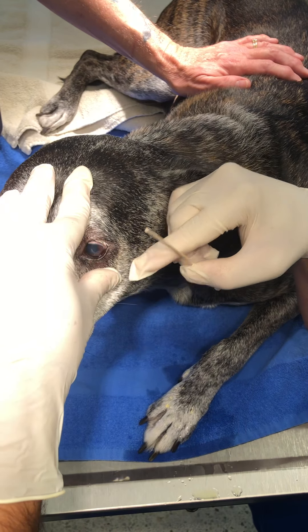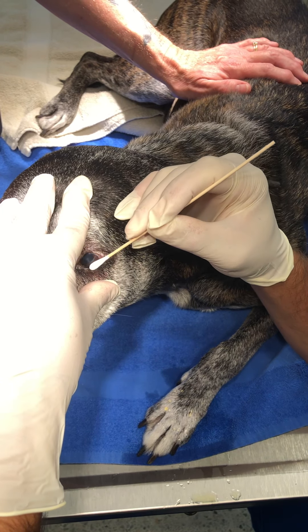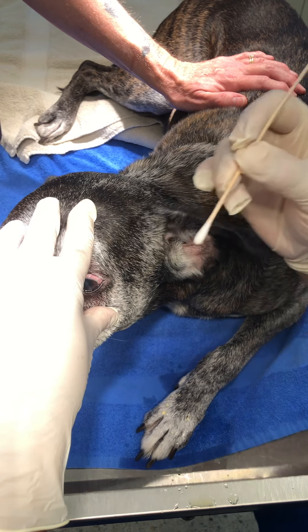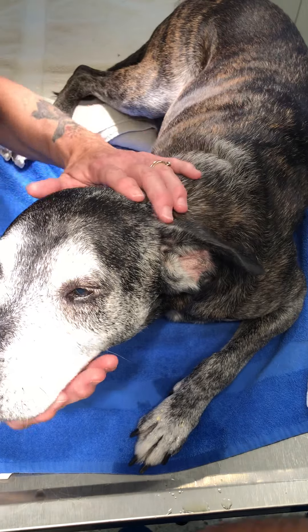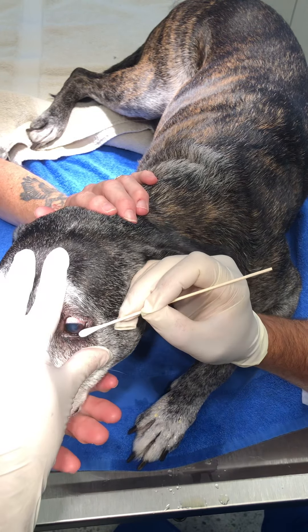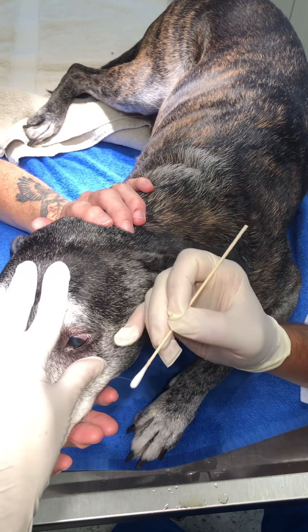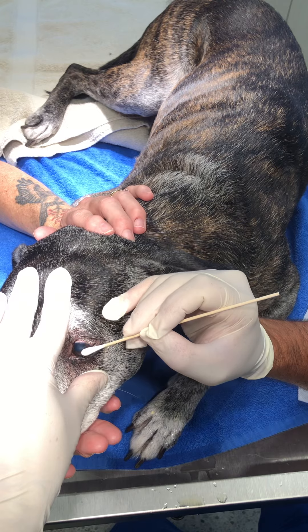You discover that the lesion is bigger than it appeared before, because you're removing the cells that are covering it. She's tolerating the procedure well, and as soon as the Q-tip gets moist it gets replaced with a new one. We can now see the loose edge of the cornea, and I'm going to try to make it as flat as possible without causing any other lesions.